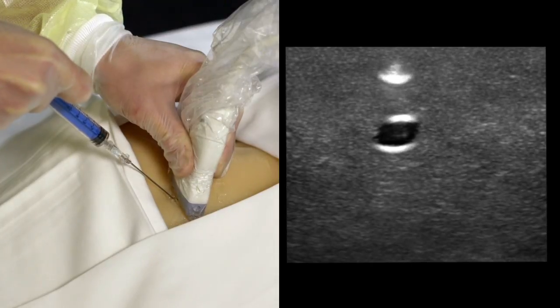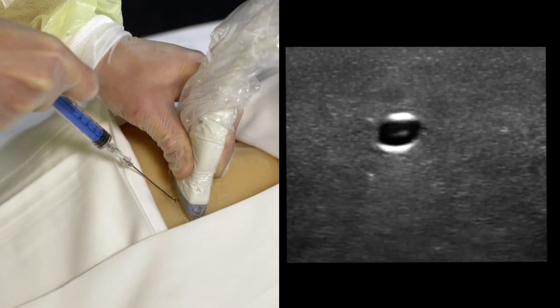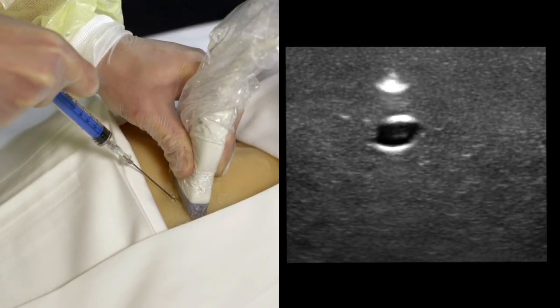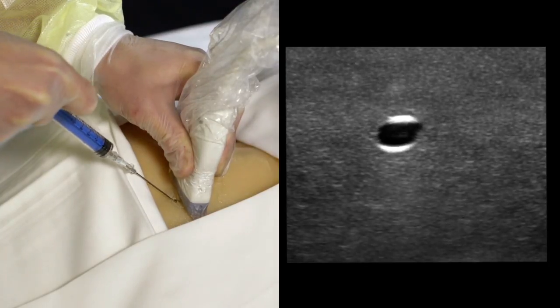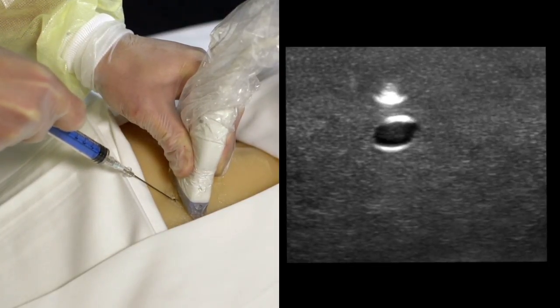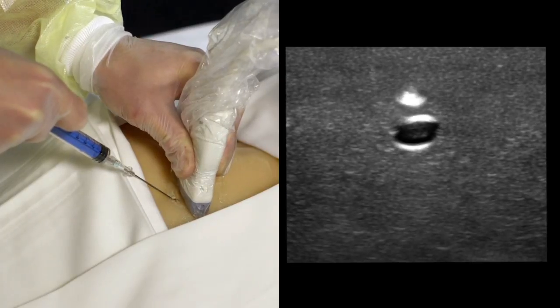Once you've identified the needle tip with your ultrasound probe, advance the needle slightly and then stop. Advance the probe slightly and again visualize your needle tip. Never move the probe and the needle at the same time as you will lose the image of the needle on the screen.